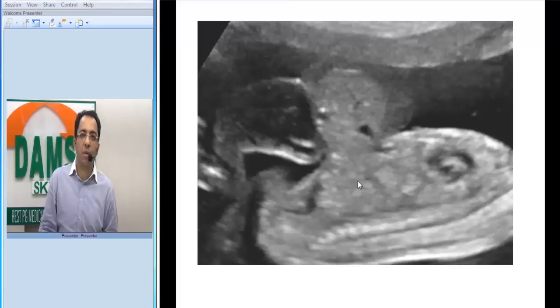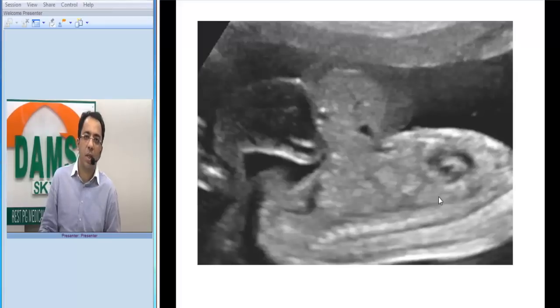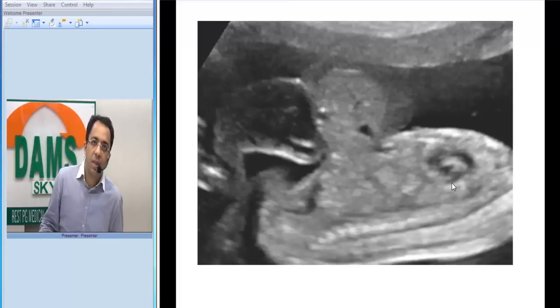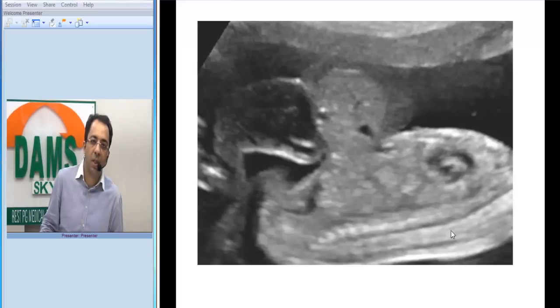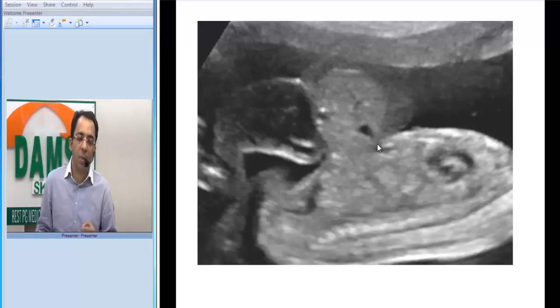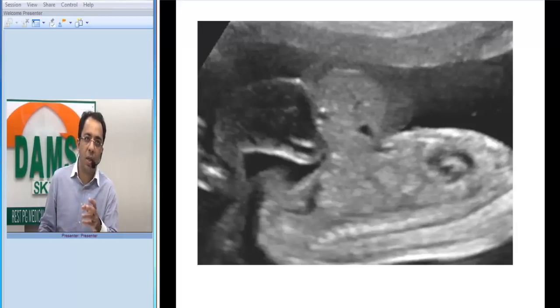Now let us confirm this on a sagittal image. This is a sagittal ultrasound image, long axis view. You can see the placenta, the amniotic fluid, the fetal chest, the cardiac chambers, and the spine. Once you know this is the spine and this is the head end of the baby, you can appreciate that this is the anterior abdominal wall defect.